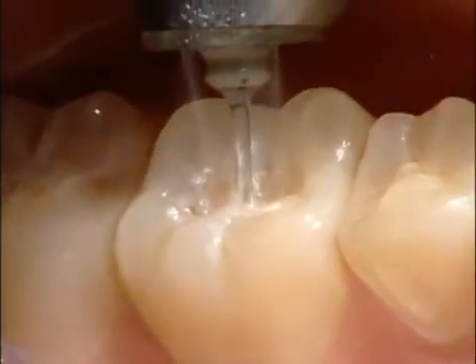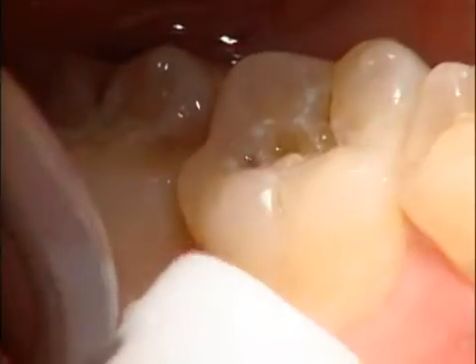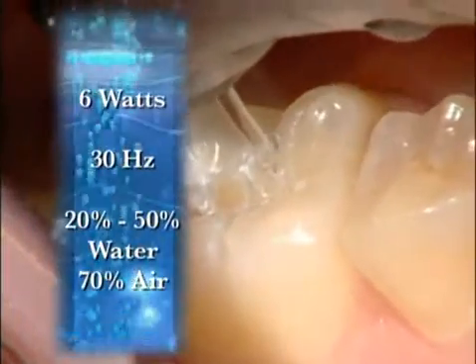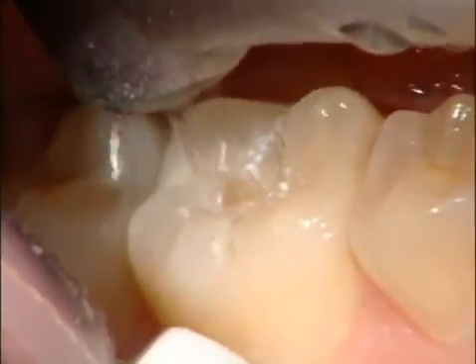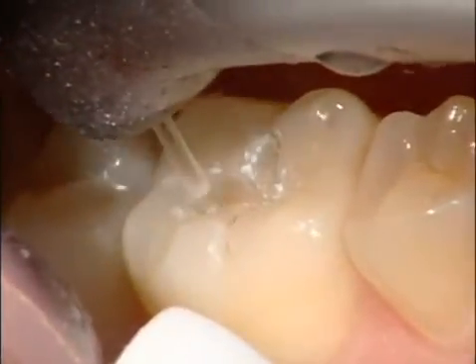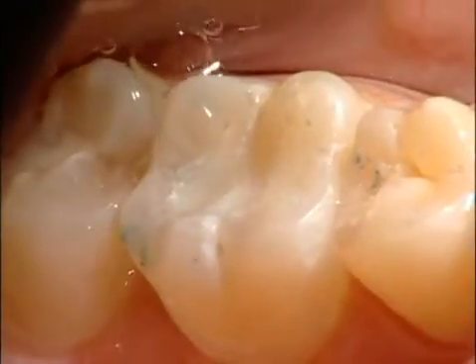After this brief period of time, the tooth should be anesthetized to where now you're ready to start your occlusal prep. The important thing in the occlusal prep is to remember to stay perpendicular as possible to the occlusal surface. We want to start with a G4 or a G6 tip. And I recommend starting at 6 watts, 30 hertz, with 20 to 50% water and 70% air. I personally found that I really like less water, 20% water. I get good efficient cutting, a whole lot less water in the patient's mouth.